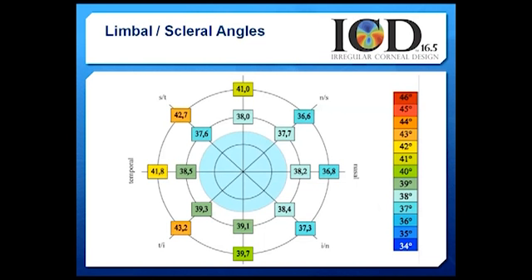Another thing that's helpful is to understand not just that the eye surface is tangent, but how the surface is shaped throughout 360 degrees of the sclera. This study conducted at Pacific University looked at the angles around the clock at the 15 millimeter chord, that's your inner circle here, and the 20 millimeter chord, your outer circle here.